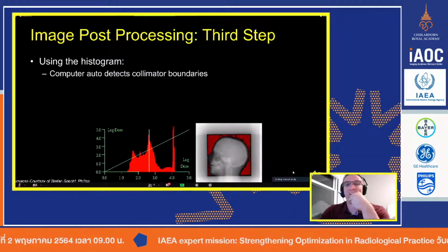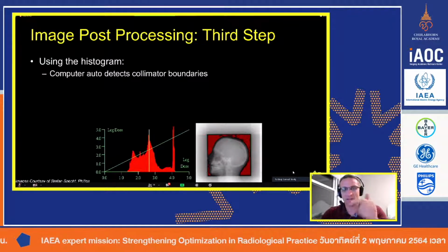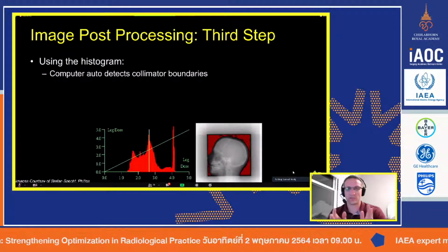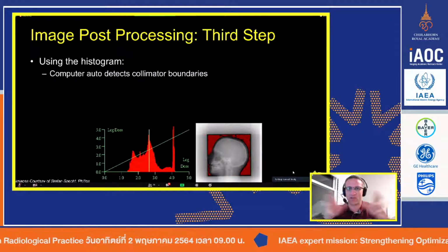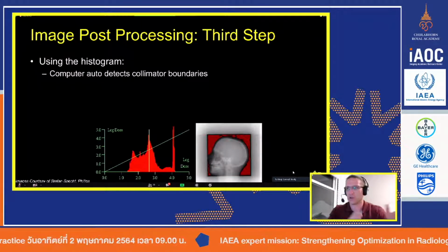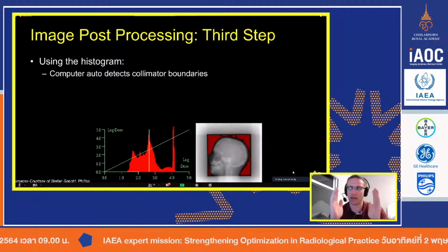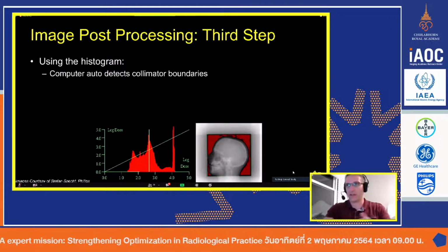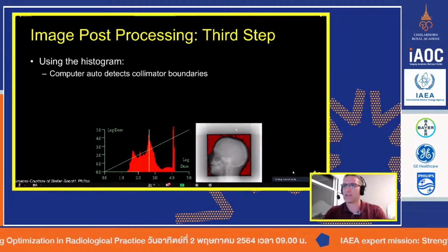Yes, and thank you for pointing that out. If you set the kV right, set your mA right, get your patient aligned right, and have your scatter grid in right, you've done all those steps right, but if you don't set your collimation right, you actually undo a lot of the good things you've done. Having really good collimation for the anatomy you're imaging matters. If it's chest, we want good collimation. If it's a lateral head, as you see on this image, you want a good lateral and you want to minimize how much air is in that image.